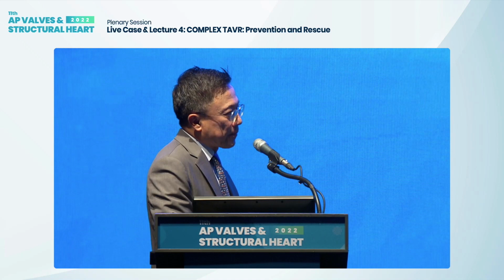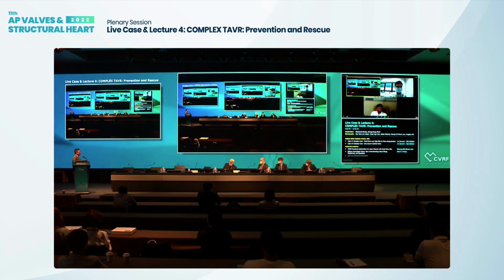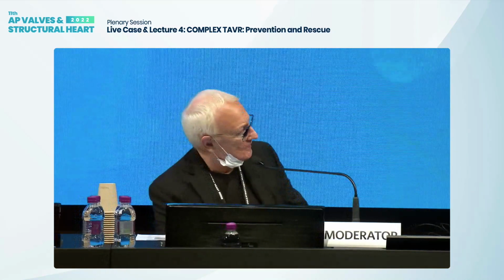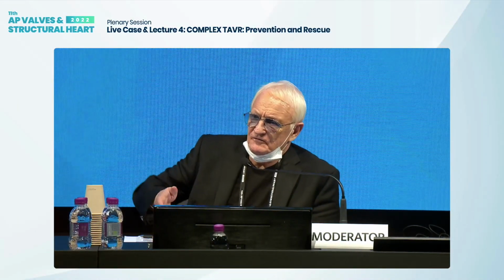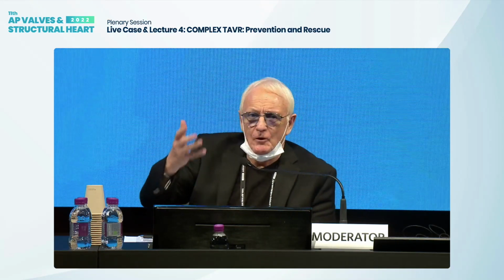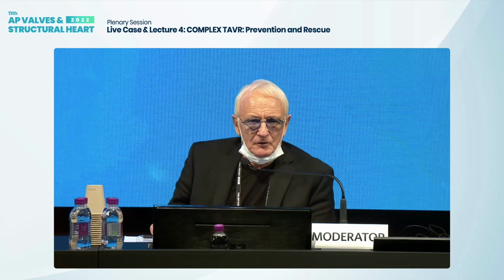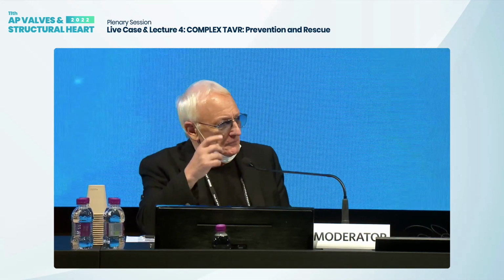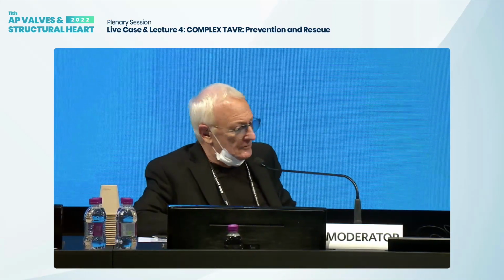If you recall, I was at that time together with Todd in Paraguay, and we did the first aortic stenosis with the shockwave. The problem there is that the flowing blood takes the sound waves away, so it's quite a challenge to do that. But nevertheless, we don't like calcium wherever it is. It's giving us a problem, no matter what.